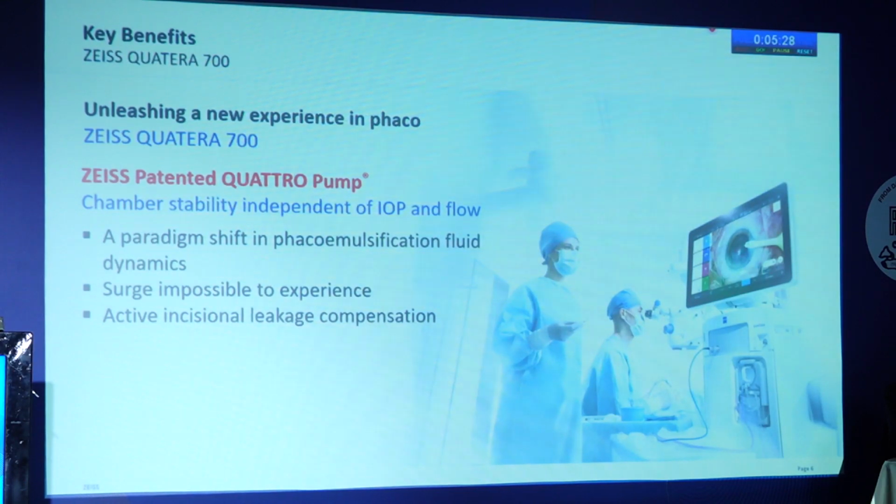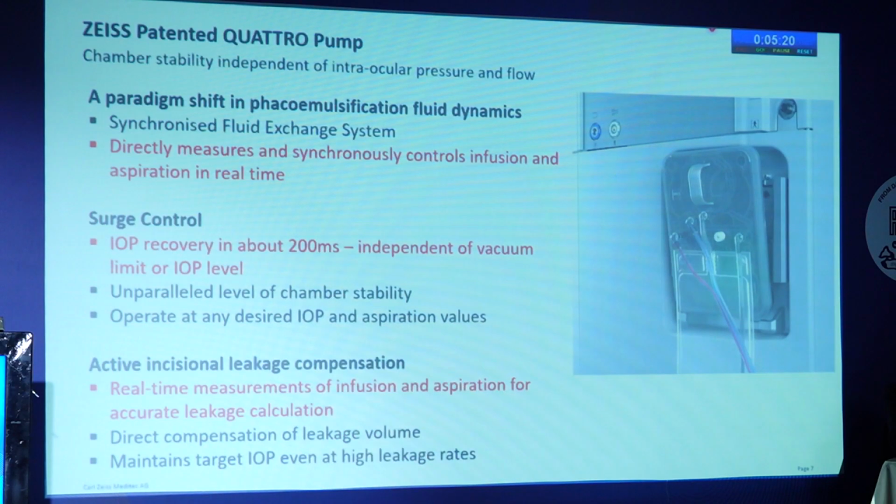Most interesting is this Quattro pump, which is patented, and the mechanism is completely different from almost all other fluid dynamics that are available. There is a synchronized fluid exchange system, and it directly measures and synchronously controls infusion and aspiration in real time. The surge control is excellent. IOP recovers in 200 milliseconds, and it is not dependent on the vacuum limit or the IOP level which is set. It can measure the infusion and aspiration volume in real time, and therefore it can calculate the leakage from the incision and compensate for that leakage.